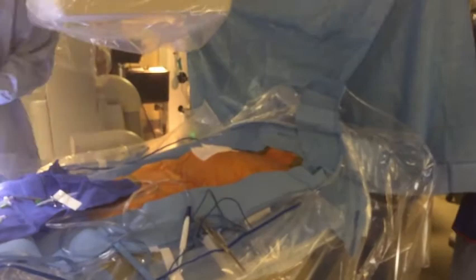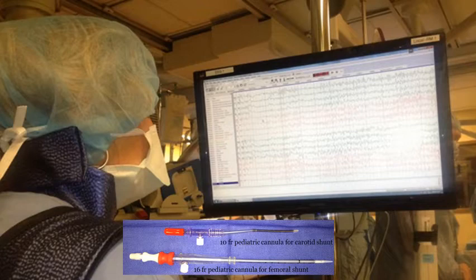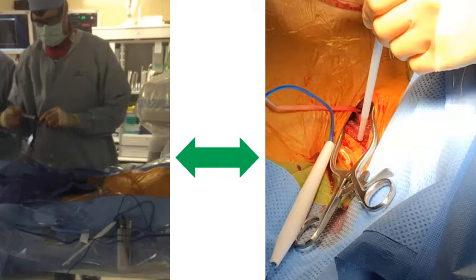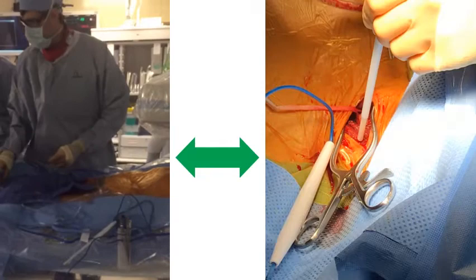This gives you a broader view of how the patient is draped, with the C-arm opposite the side of the carotid access. EEG is used to determine if femoral-to-carotid shunting is required; however, to date, this has not been necessary in any of our cases.